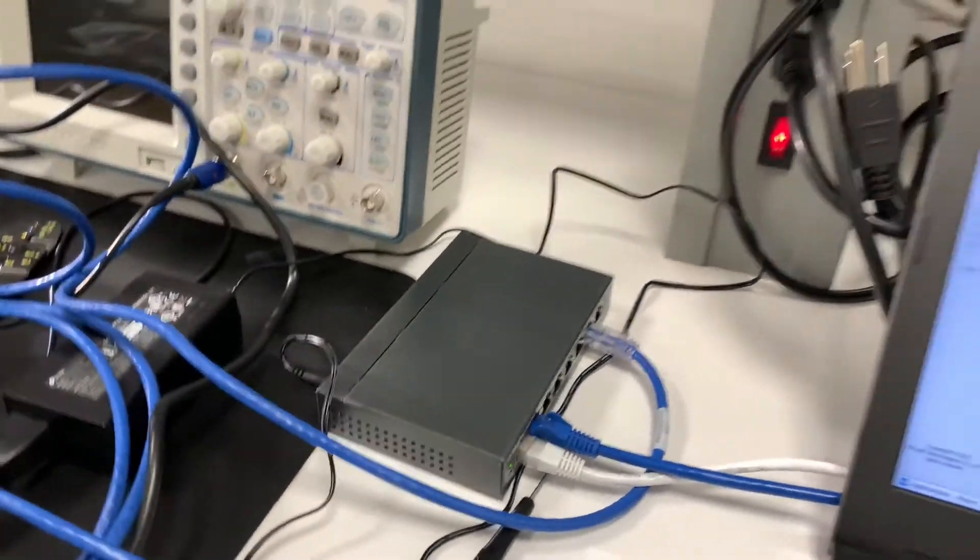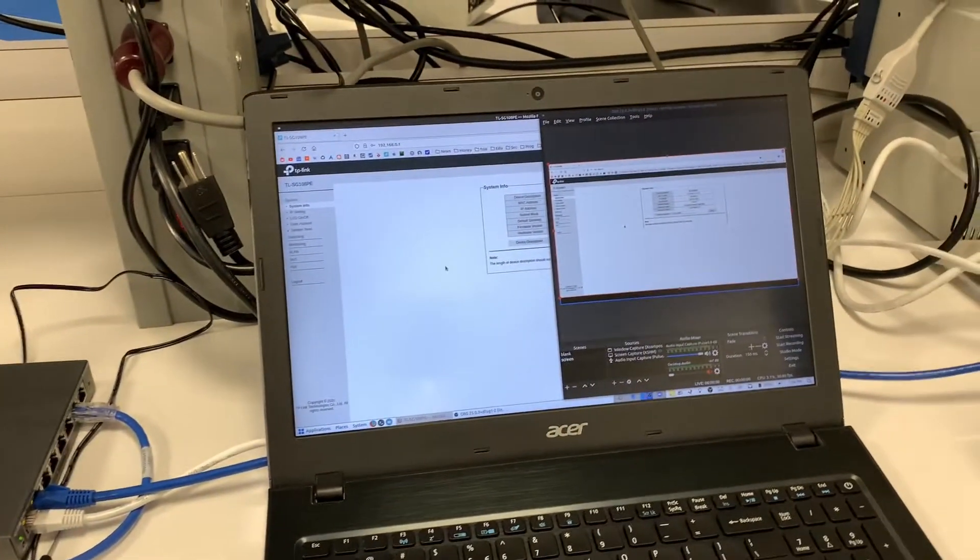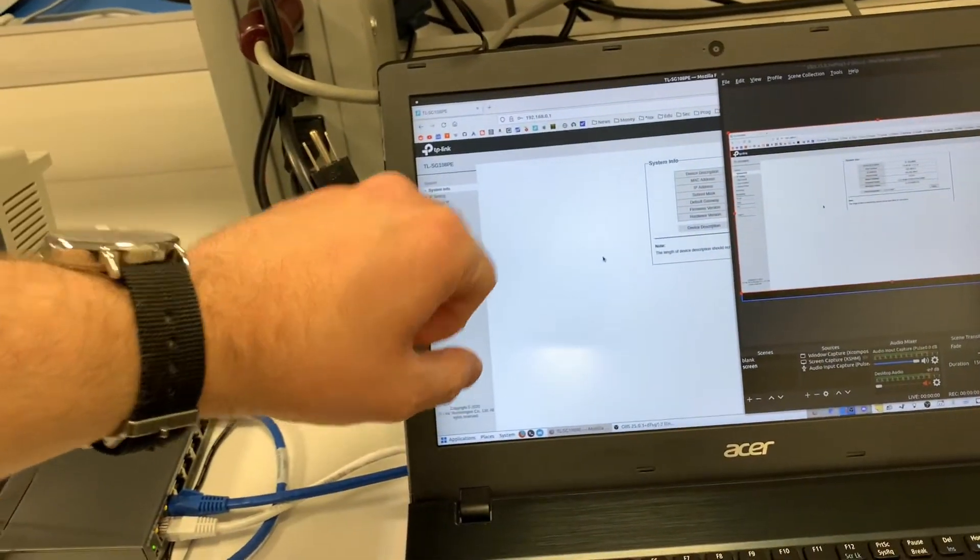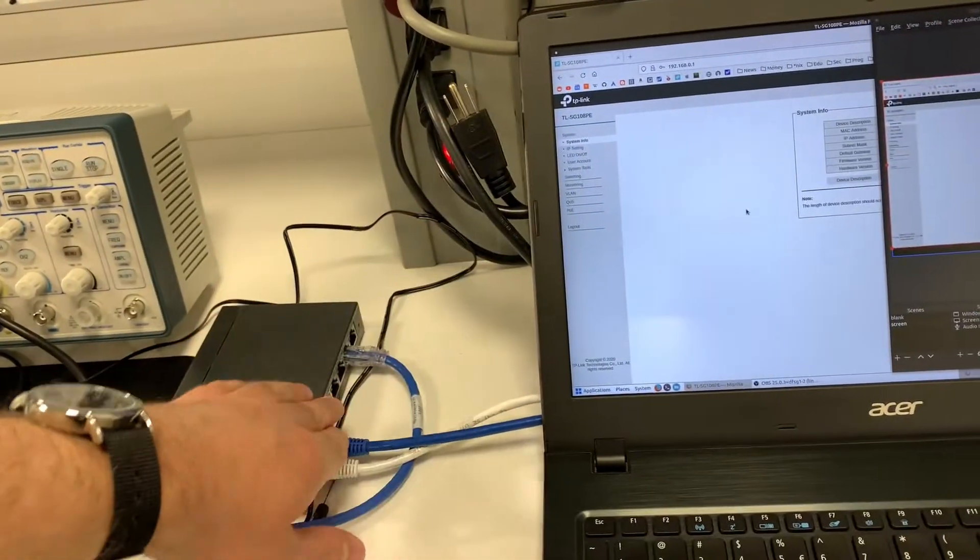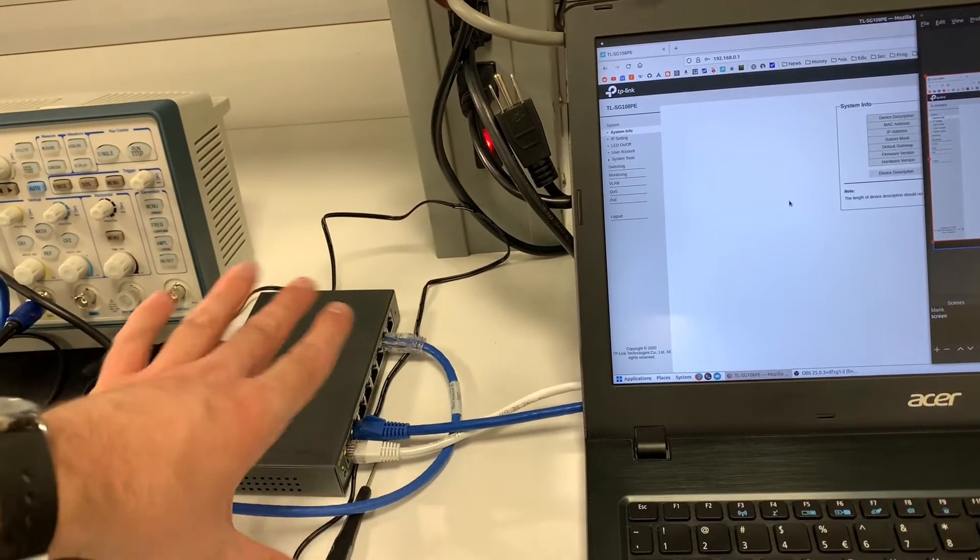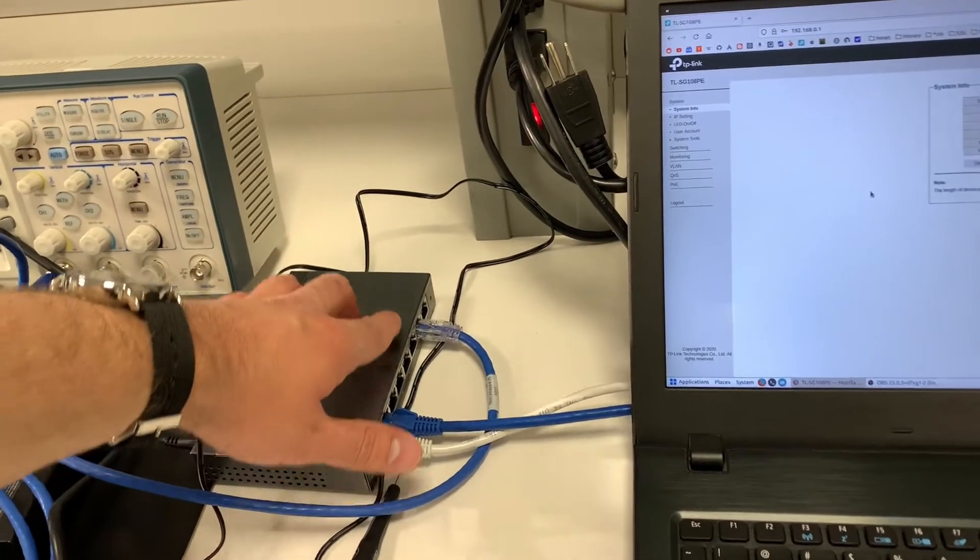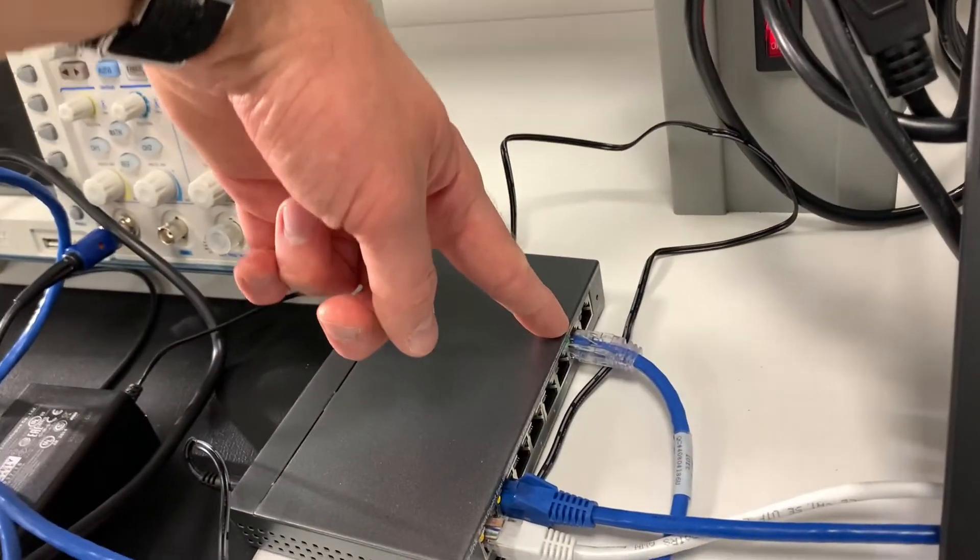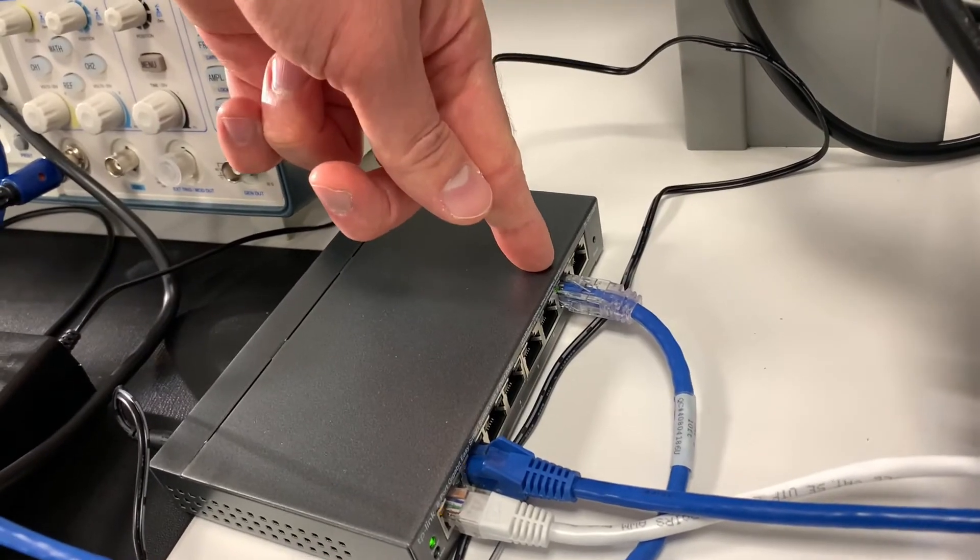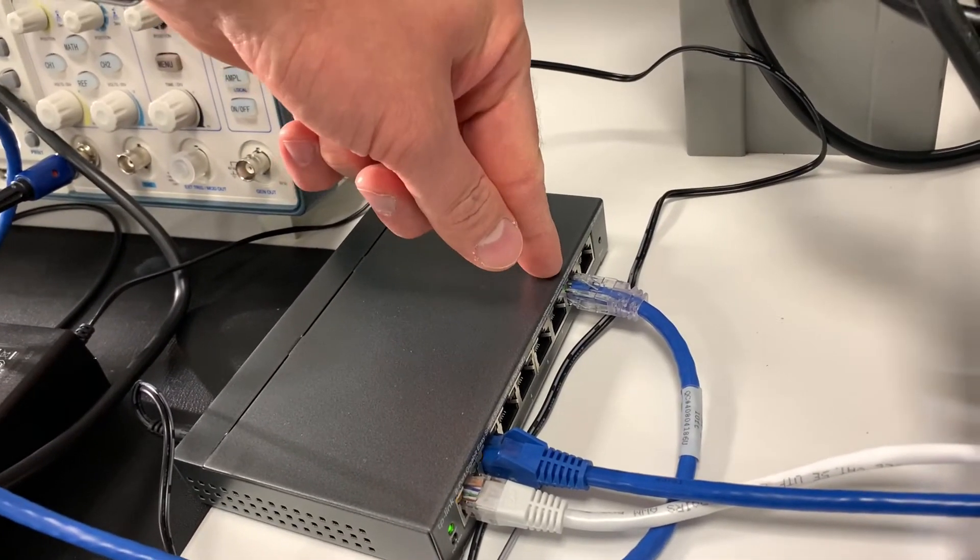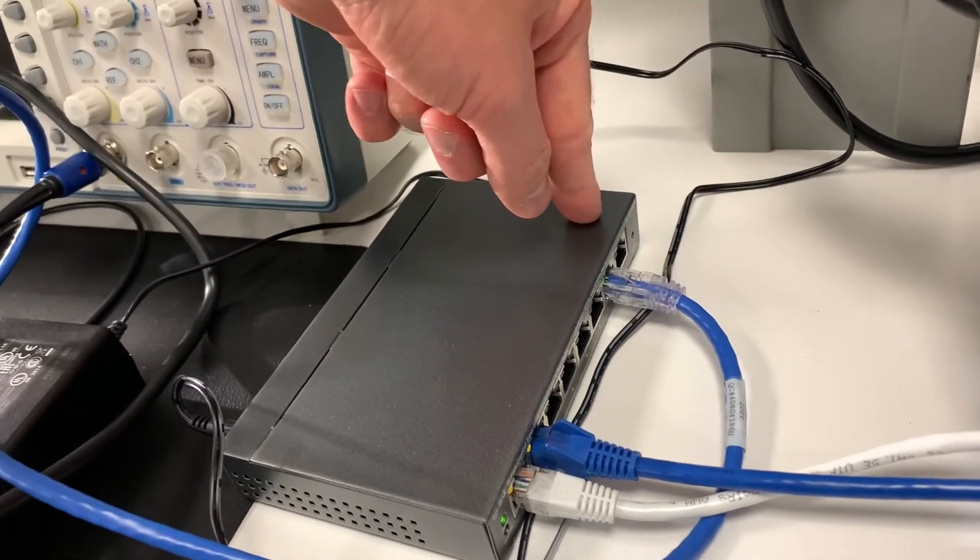And that is for the setup process. What we need to do is log into the switch interface and set up port mirroring and enable it on that port. And to avoid any kind of traffic collisions, we want to do that on a port that's not going to be our mirrored port. So that's why I have it plugged into port 7 right now. But when we have port mirroring enabled, we're going to take it out of port 7 and put it into port 8.